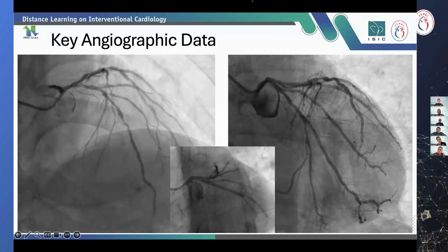Yeah, thank you, Dr. Fauzi. Of course, considering that this patient has suffered from hypertension and is also elderly, which is known to be associated with medial calcification, and secondly, we also appreciate the long lesion with a distal run-off that is quite good.